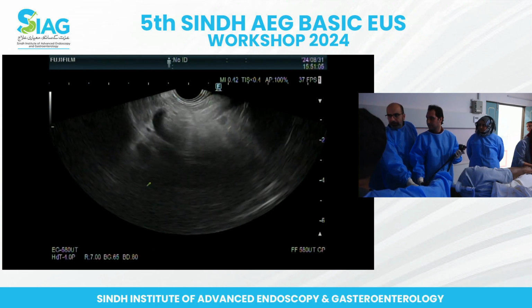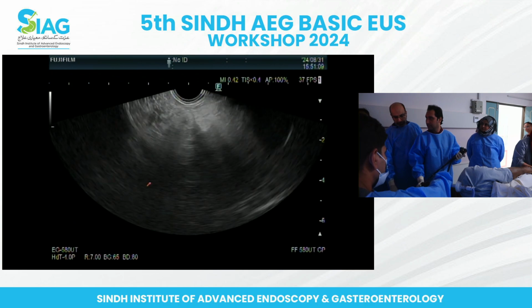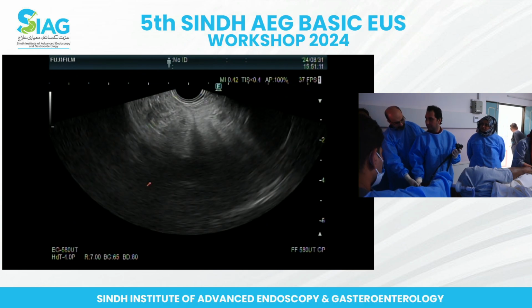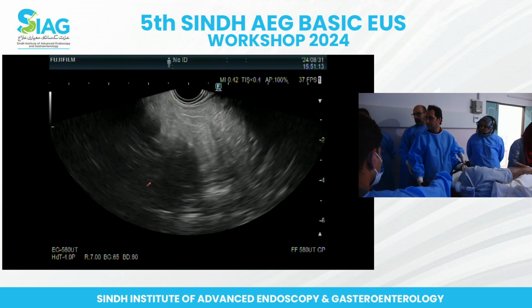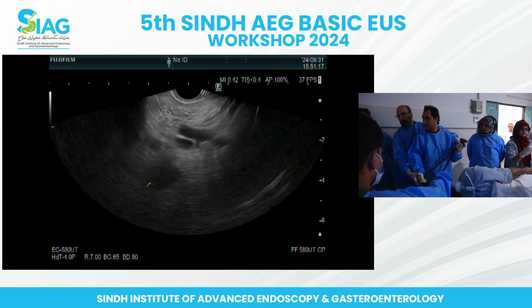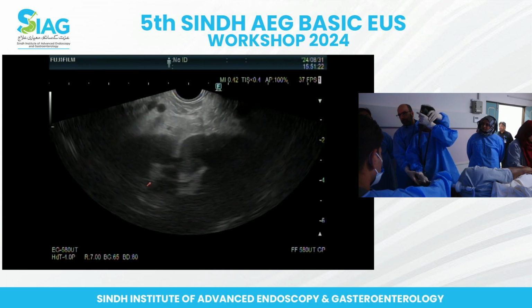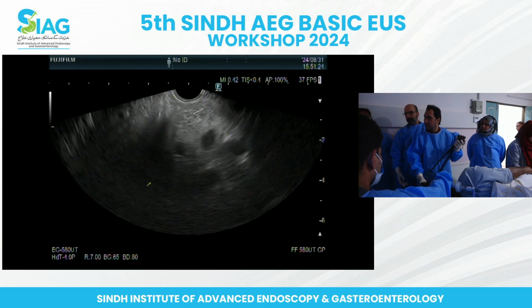So push forward a bit because your pancreas is off. Okay, good. And yeah, relax this. And this should be the one doing all the work. There you go. And push forward a bit. There. From here, down and see that? Yeah. So try that.